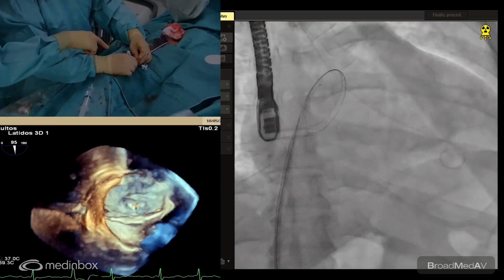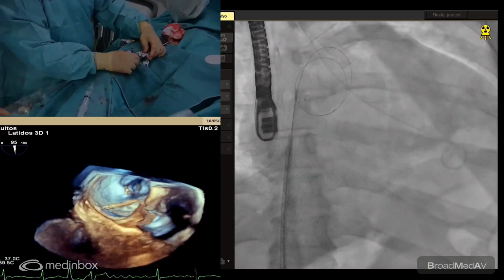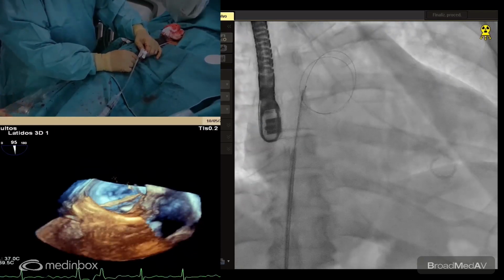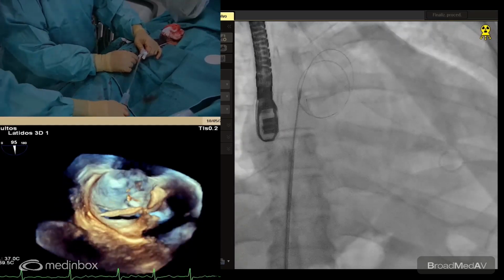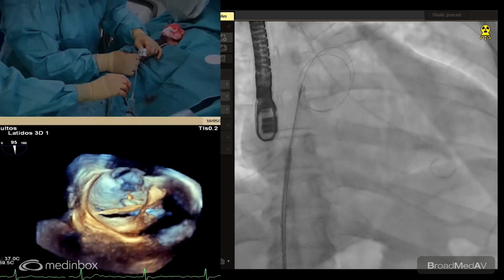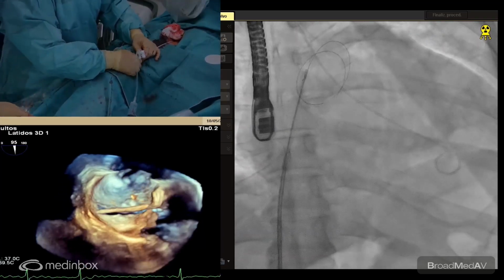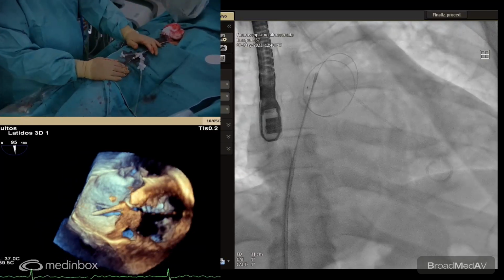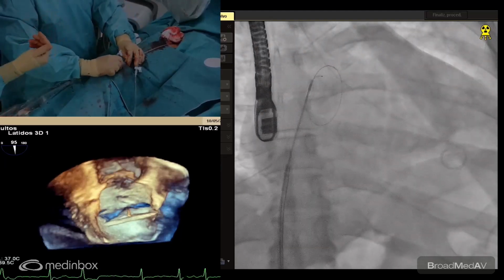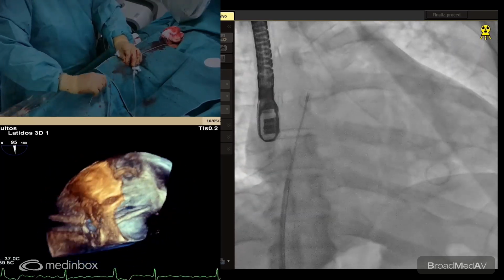Okay. The wire is there, up in the left atrium. We're going to advance the silver one towards the golden one, metal with metal. And now, gold against the key lock. Metal with plastic, okay? We retrieve a little because of the perforation. Okay. Lock is perfect, stretching. Yeah, it's good. And now we retrieve the wire. A little bit of the balloon as well, because you're in the center. Okay, it's okay.